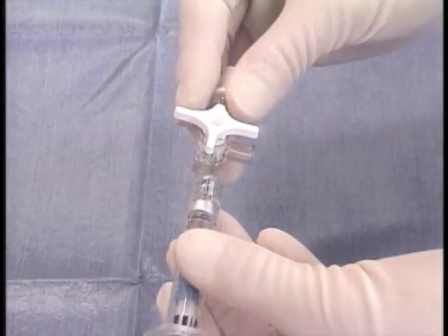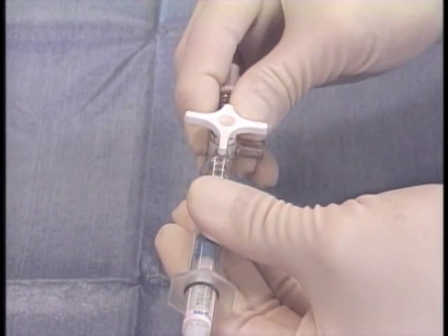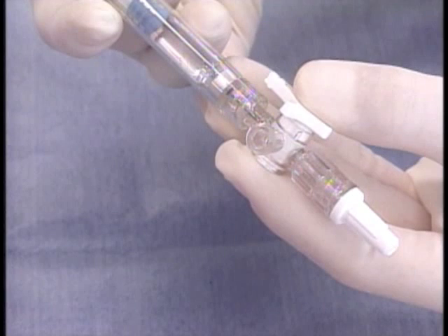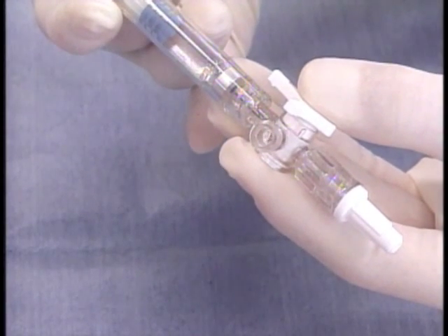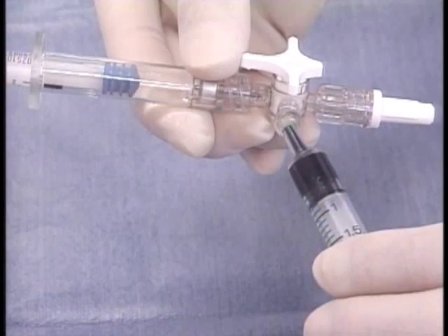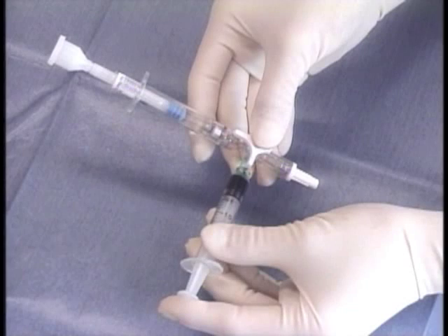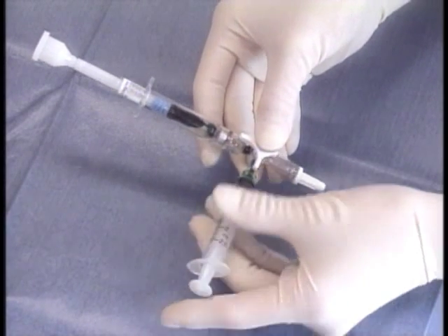A three-way stopcock is always used to mix the sodium hyaluronate and dissolved ICG. A sodium hyaluronate syringe is connected to the stopcock and the sodium hyaluronate is injected from the other end. The dissolved ICG syringe is then connected. Alternately pressing the plungers completes the Visco-ICG.